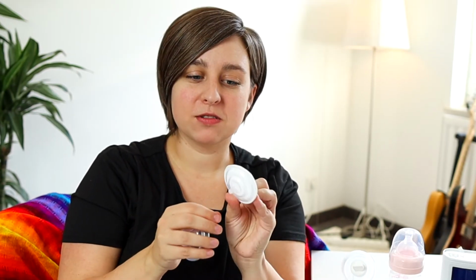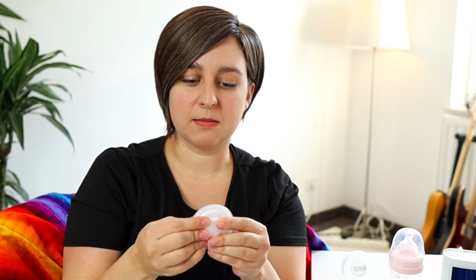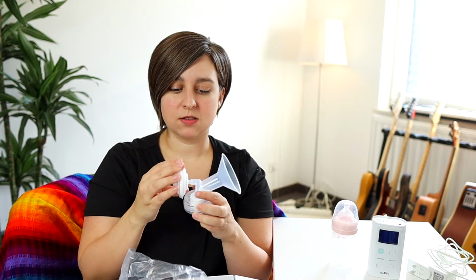That white piece goes around the smaller end. You just got to make sure you get it all the way around. And then that bigger piece clamps on top of it. These only go on the flanges one way, so you really can't screw that up.